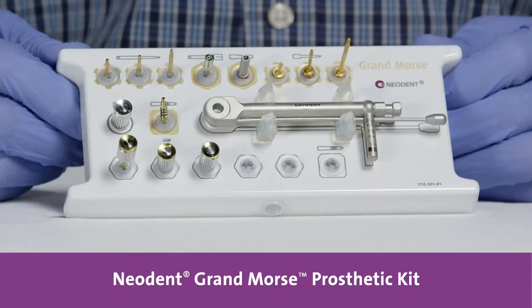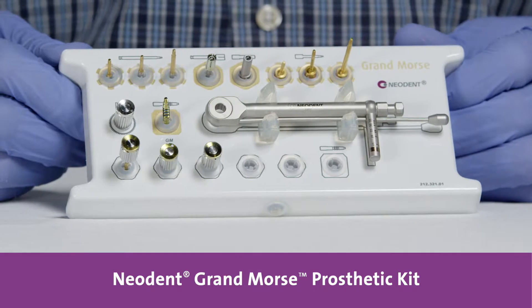Hi, I'm Alex Molinari. I'm with NeuDent. This is the NeuDent Grand Mars Prosthetic Kit.